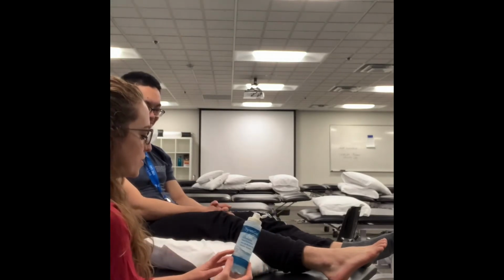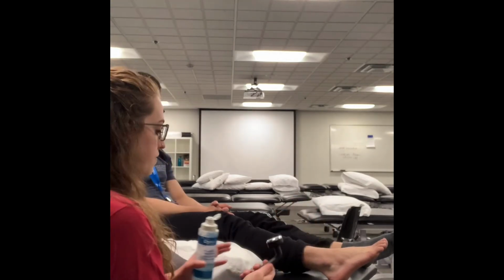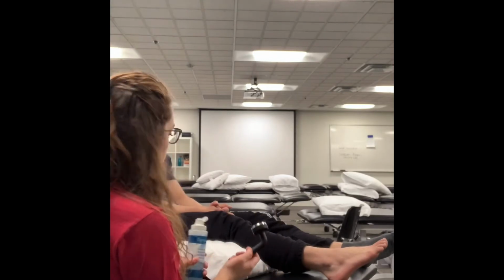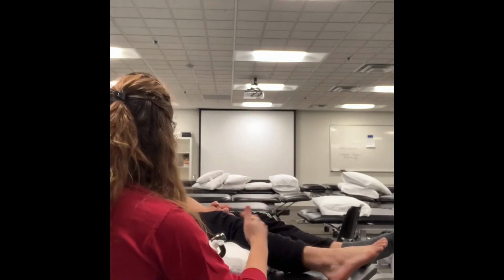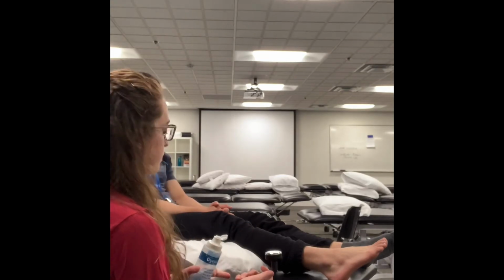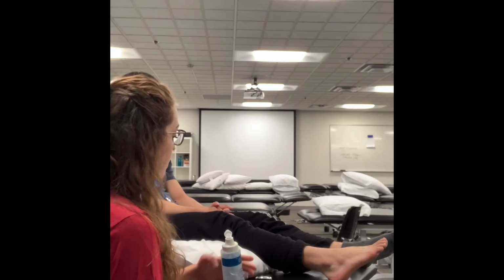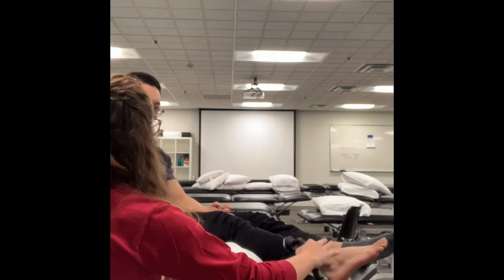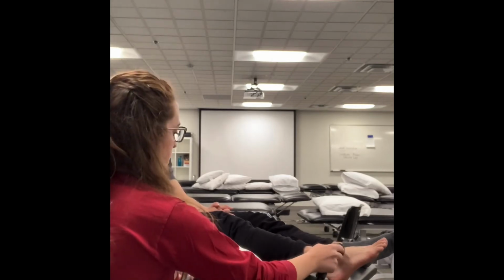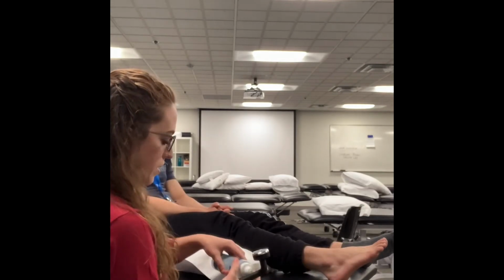Okay. So it's a gel that we put on the head of the ultrasound machine, so that it has a buffer between your skin and the head of this. And then also the head of this is the ERA, the effective radiating area, and I'm only going to do about 2 to 3 times as big as this area around your ankle. Okay? Okay. All right.